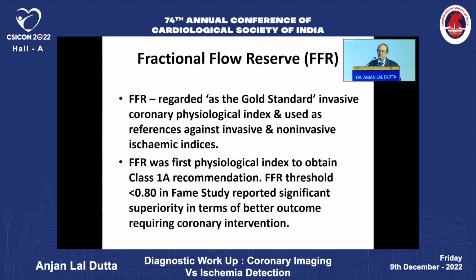Regarded as the gold standard invasive coronary physiological index and used as a reference against invasive and non-invasive ischemic indices, FFR was the first physiological index to obtain class 1A recommendation. An FFR threshold of less than 0.8 in the FAME studies and other studies reported significant superiority in terms of better outcome requiring coronary intervention.